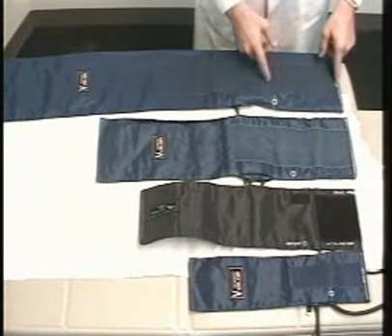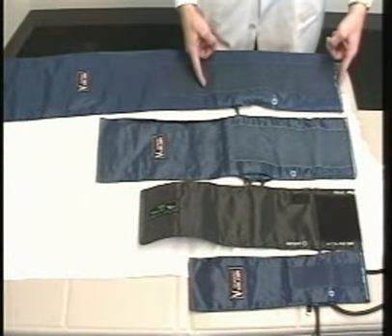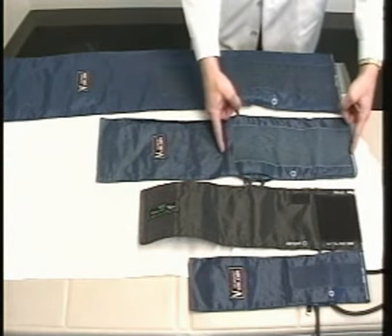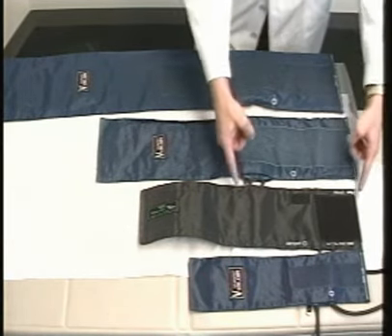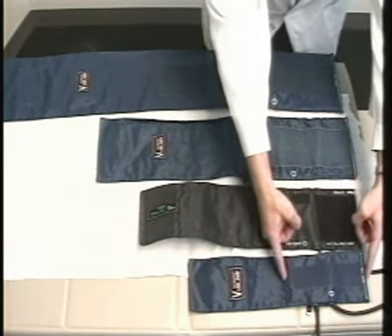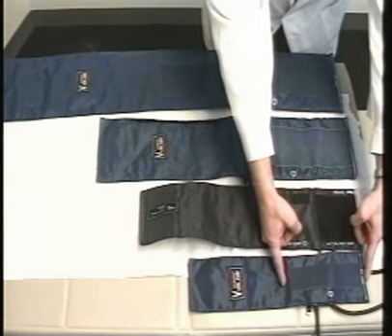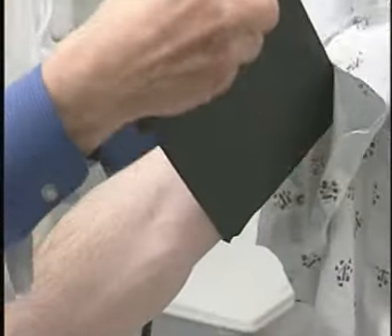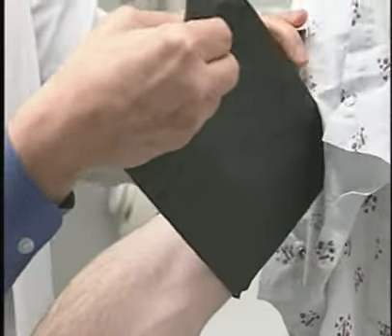The length of the bladder does not represent the entire length of the blood pressure cuff. Notice where the tubes come out of the blood pressure cuff, and notice that that area is thicker. This is where the bladder of the blood pressure cuff is, and it's the length of the bladder that we're interested in. That should be 80% of the circumference of the arm to be the correct size. So a normal adult cuff fits that just fine.